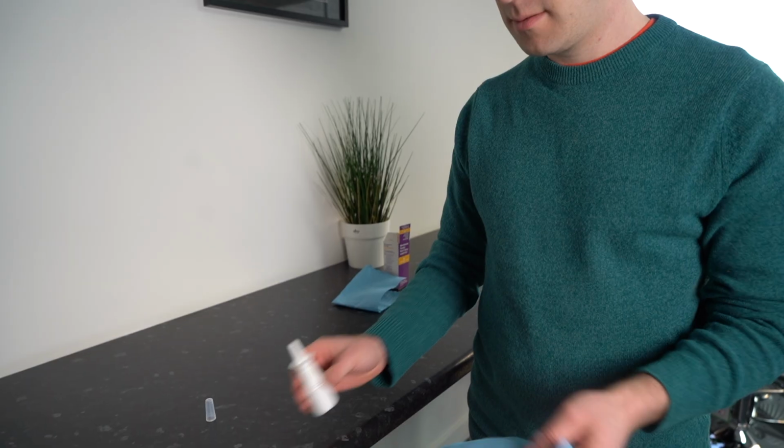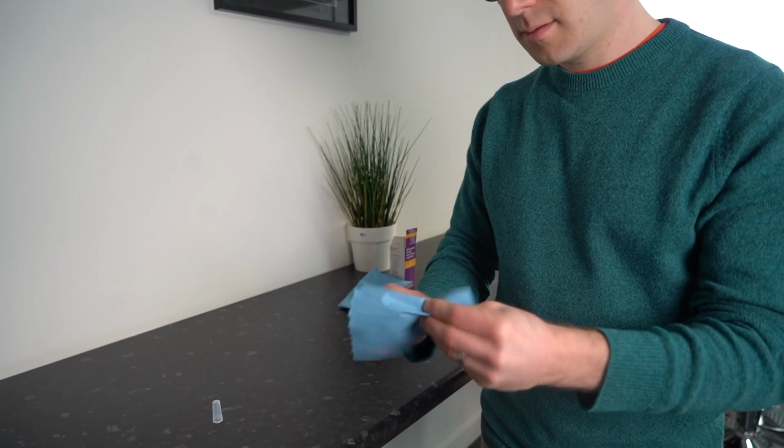Start to breathe in gently or slowly through your nose, and whilst taking a breath in, squirt a spray of the mist into your nose by pressing down once with your fingers. Breathe out through your mouth, and if you need to do a second spray, repeat the previous step. Obviously, you will want to repeat this for the other nostril if this is indicated. After using the spray, wipe the nozzle clean with a tissue and replace the dust cap.